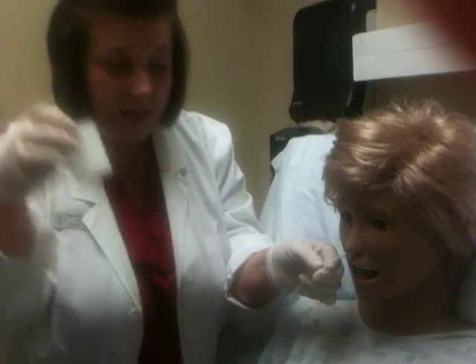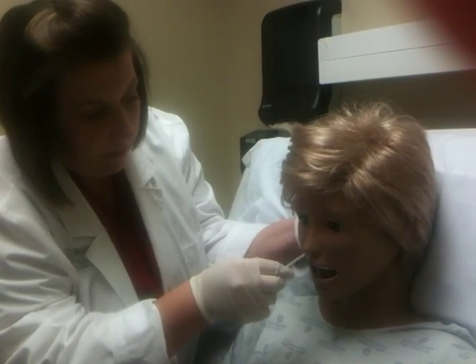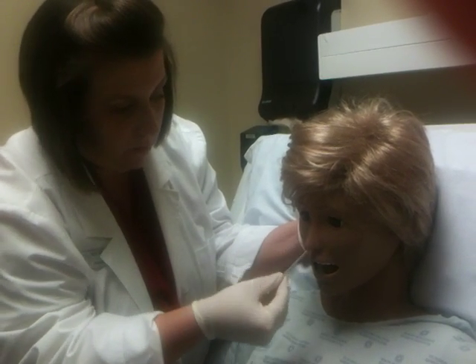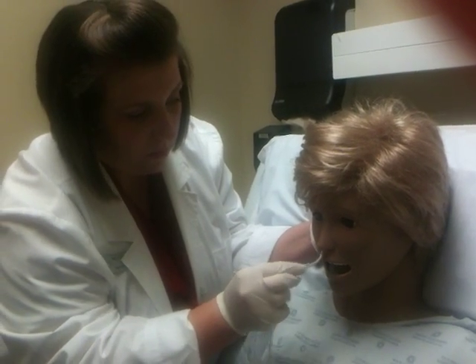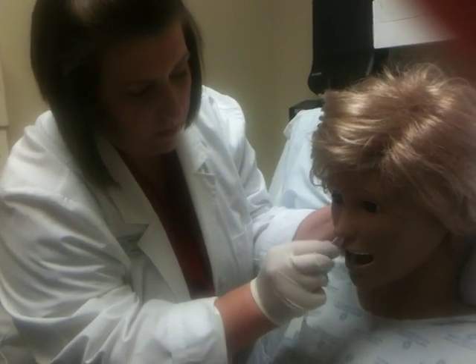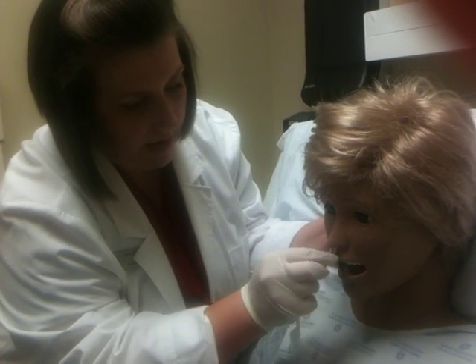I get my ice chips. I give her some ice chips. Okay, we're flexed forward. I ask her to swallow. And each time she swallows, I advance the tube. Swallow. Swallow. Swallow. Okay.